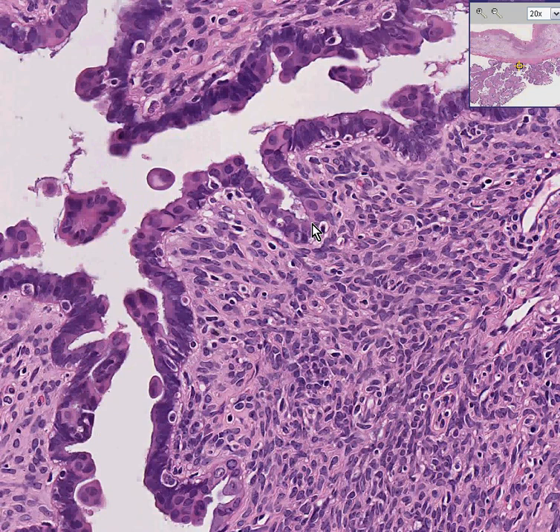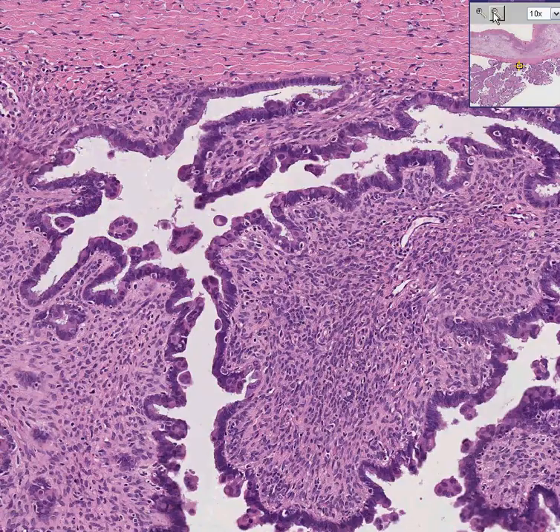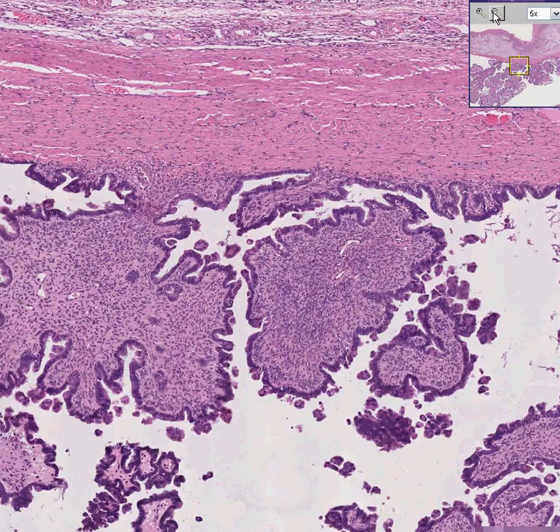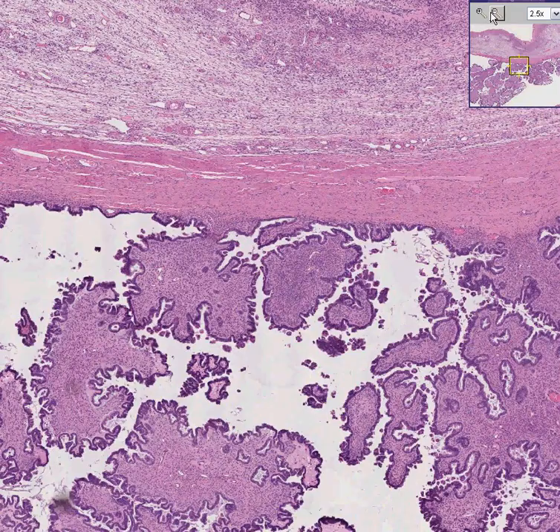Specifically, it could have been called, for example, a papillary serous tumor of borderline, or perhaps of borderline malignant potential. Thank you very much.